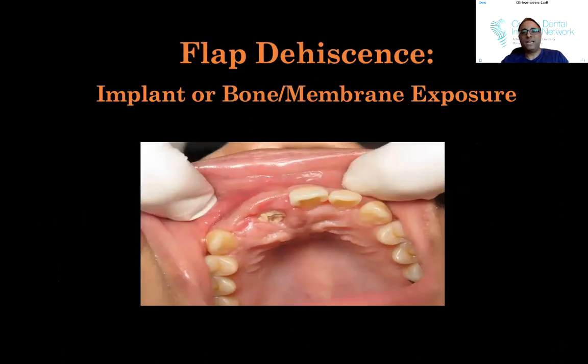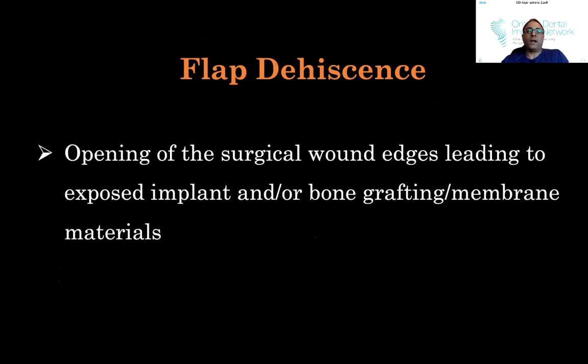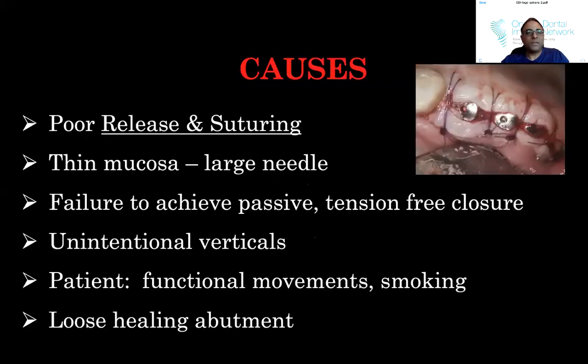Now, flap dehiscence, okay? The implant, the bone, something gets exposed. And ultimately, it's the opening of the wound edges leading to exposed implant. And normally, that's your fault. Okay, let's be honest. It's typically from poor release and suturing. It just doesn't look nice and clean. You'll see the upper right, it's just nice, it's clean. I've tested my sutures with a probe, as many of you know I do. I pull up on the sutures to make sure my knots are tight.